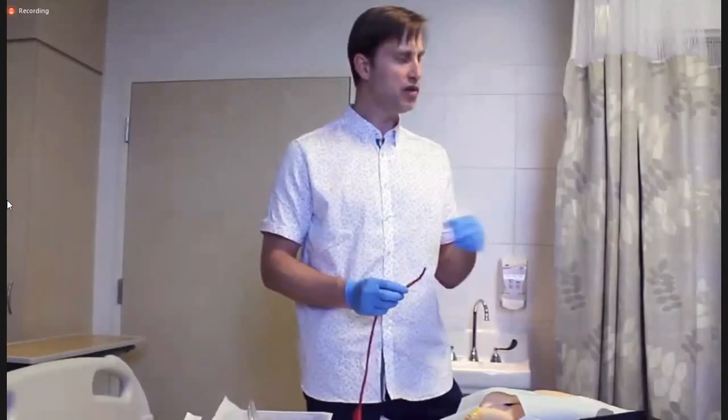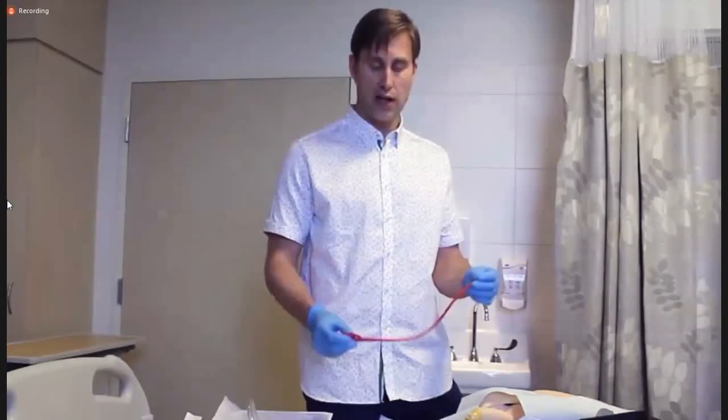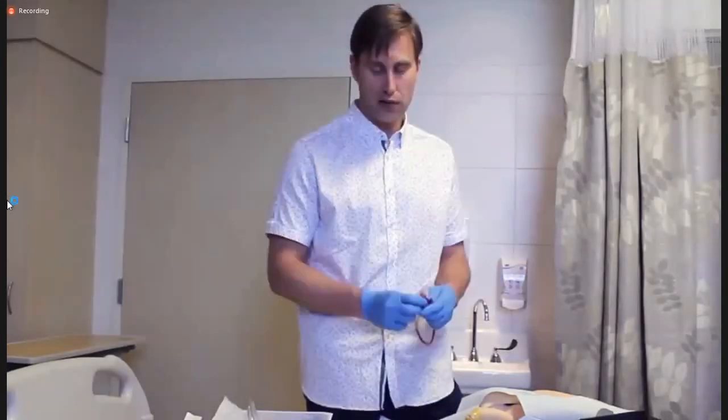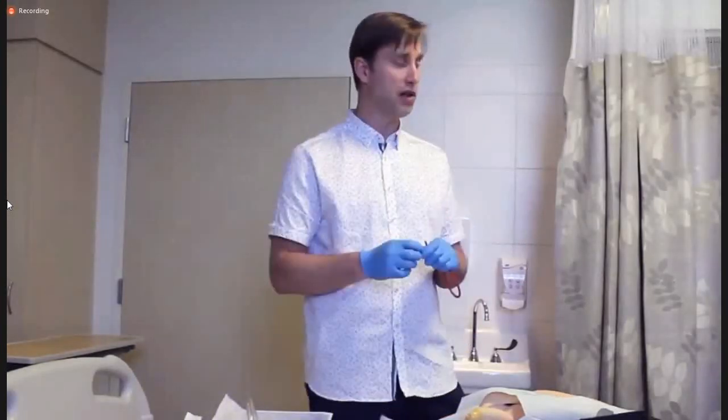About halfway down the urethra. In those instances, you should probably suspect a urethral stricture. And then what you could try is smaller catheters. If you're using a 16, maybe try a 14, or even go down to a 12 or 10 French. You might be able to negotiate through that area of narrowing.